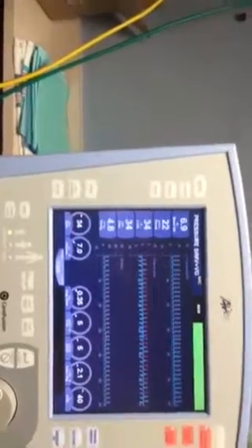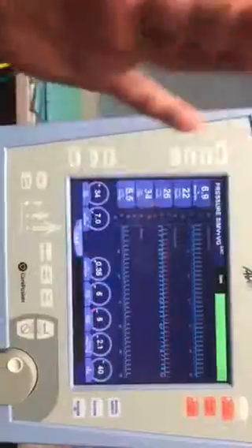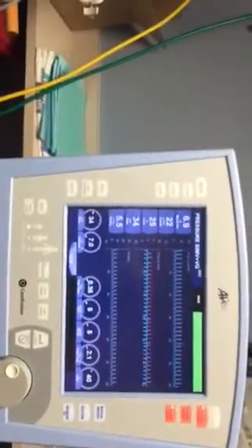Okay? So let's watch what happens. Take away flow means we are not doing anything with the flow. The machine does it. The machine's doing it all automatically. This is all automatic, okay?